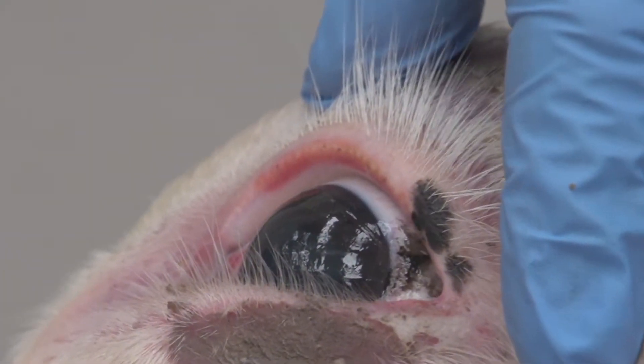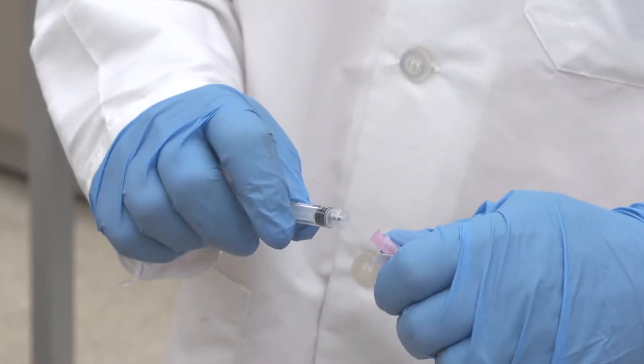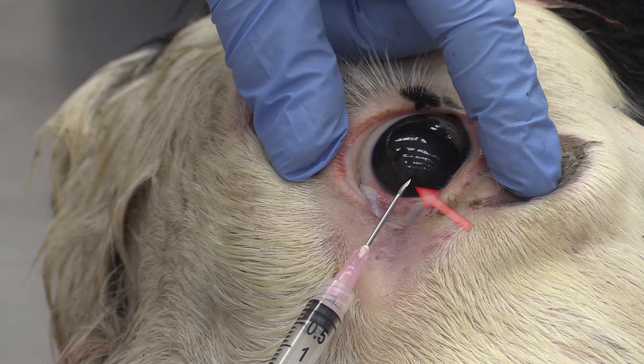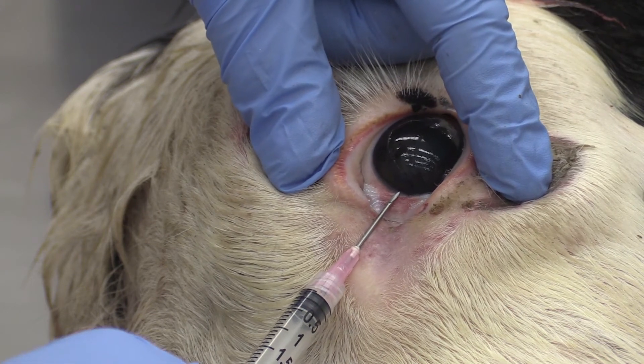To begin, clean the eye of all debris. Using an 18-gauge 1-inch needle on a 3cc syringe, insert the needle with the bevel up at the medial canthus of the eye. Make sure you are anterior to the lens of the eye.